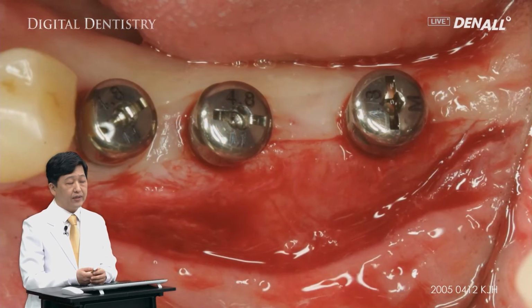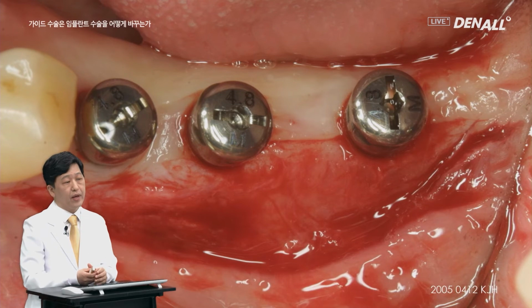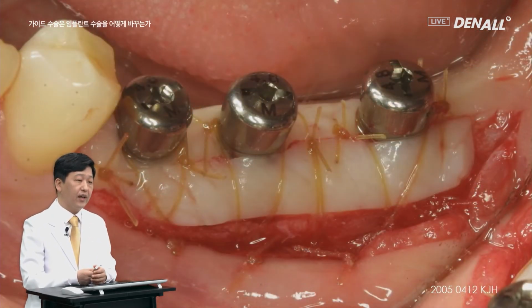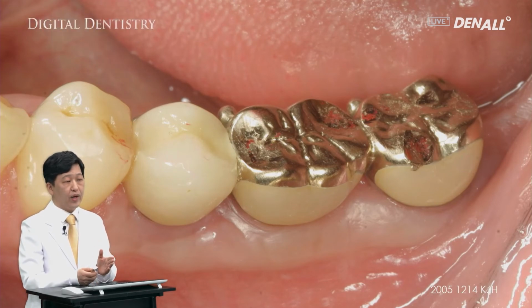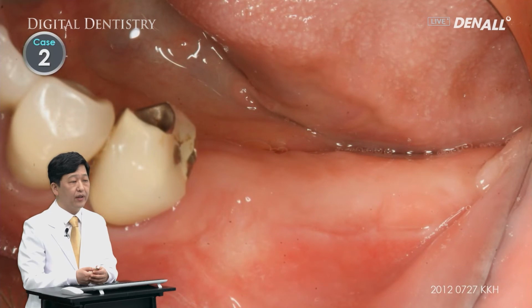Therefore, through second stage surgery, the healing abutment was first connected and a bed was created. As shown, free gingival graft was done. Finally, stock abutment was used. Number 35 PFM crown was used. Number 36 and 37 metal occlusion prosthesis were used. As you can see, around the crown, keratinized tissue has been formed. This is the completed image.